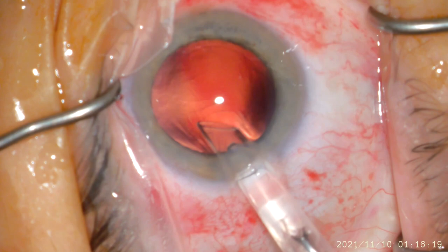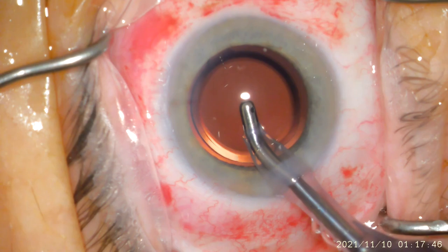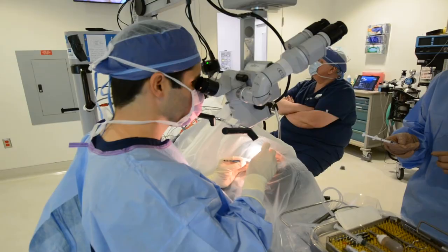Once this is done, we are getting ready to introduce the new lens, aka the IOL. This has been selected and customized to your eyes and visual needs. This will be an acrylic or silicone material lens that will last you for the rest of your life.